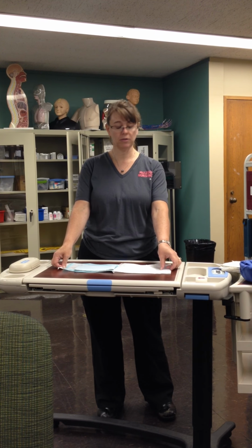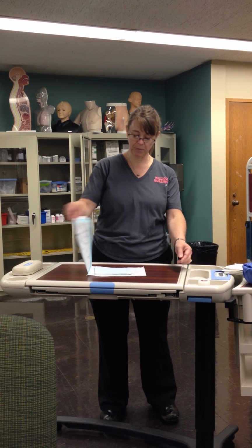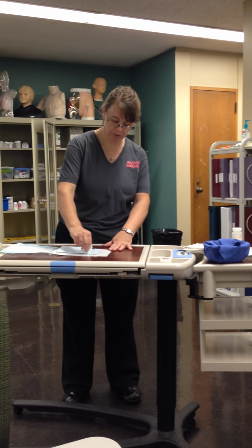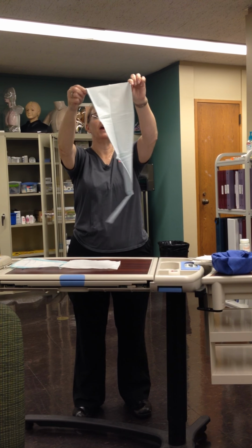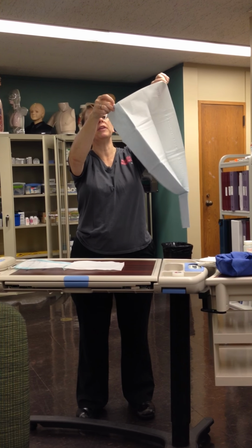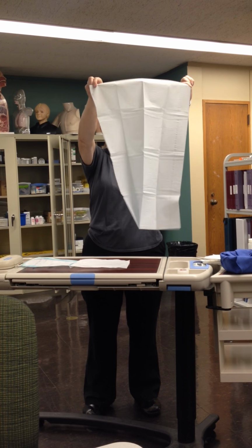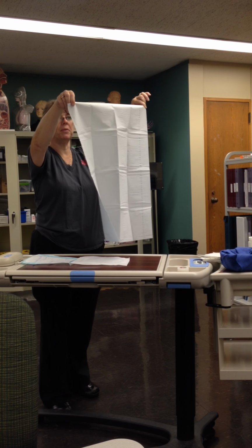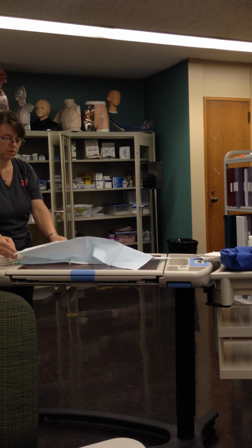When I laid this down, I laid the top that I need down, so I'm just going to flip it. Then I'm going to reach and pinch a corner and lift up. The blue side is the side I'm going to put down. And remember, I can touch around the border, what's the border? 1 inch. So I can touch up here. Now the one thing you can't do is flip it up in the air real high. So we're just going to lay it down.